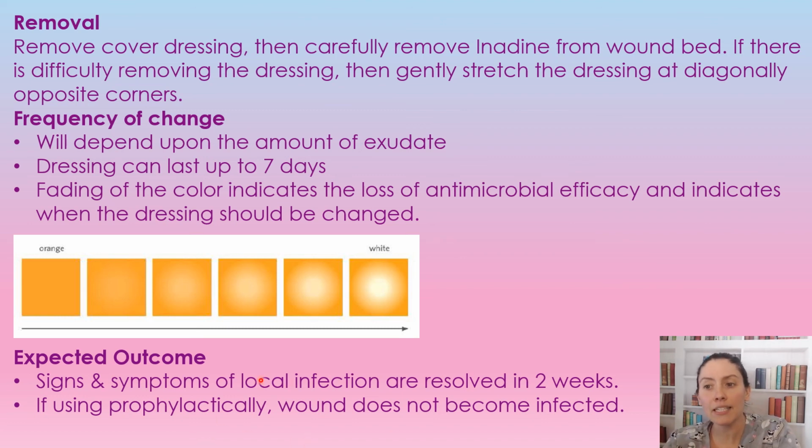And the expected outcome is that the local infection is resolved within 2 weeks. If you're using it prophylactically, the wound is not going to become infected.